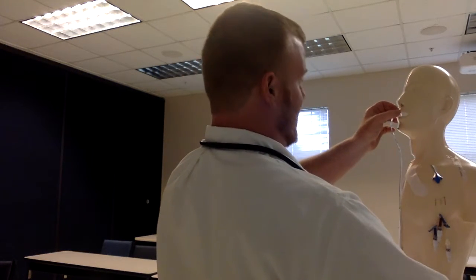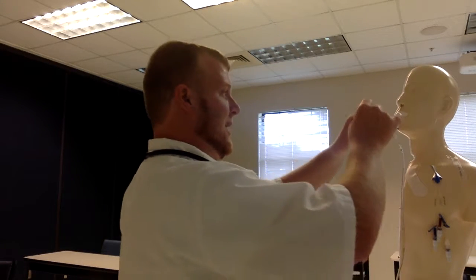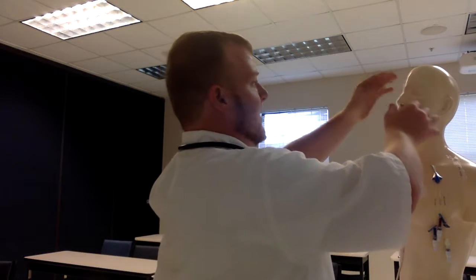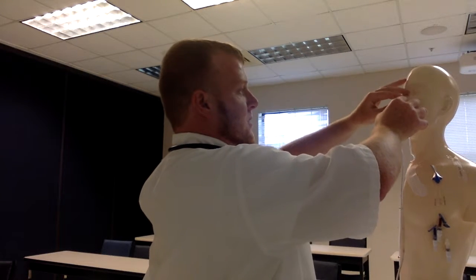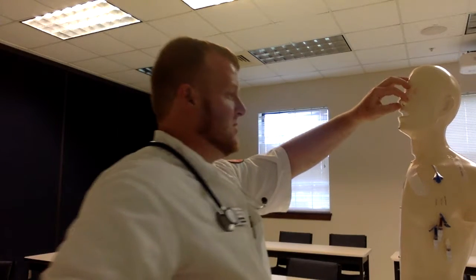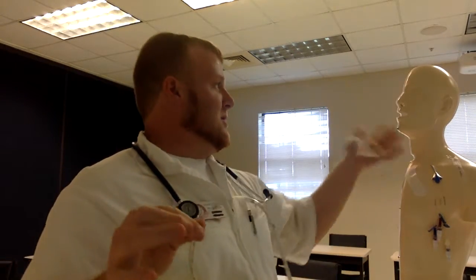Take it all off. Now this is going to be a fast, just one motion, just out. We're going to start here and just tell them to take a deep breath. It's going to be a little pain and discomfort, but it's going to go really quick. Just steadily and out. Just in here now, and make sure that they're okay.